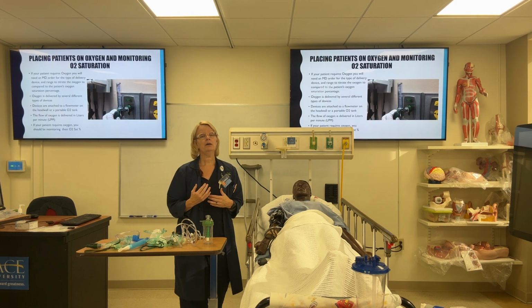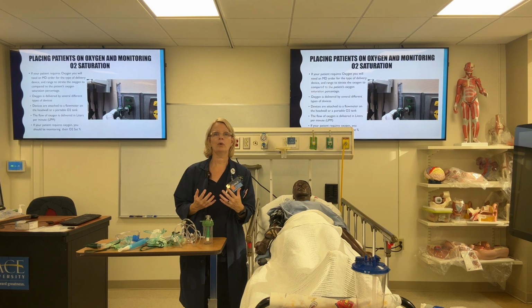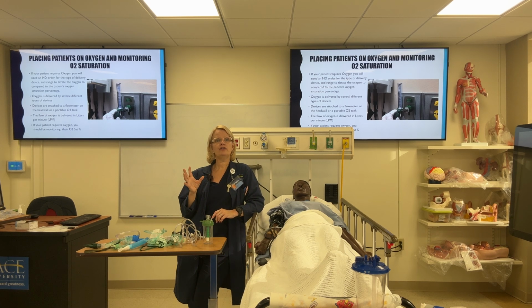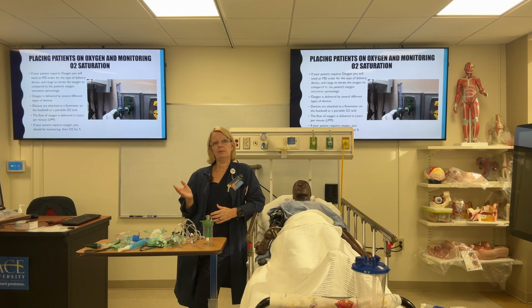When you do finally get the patient on oxygen or get an order for oxygen, you're typically going to see in the order set that the doc will write an order for the patient to be on oxygen, and that you have the ability to titrate the oxygen to maintain an O2 sat of, let's say, anywhere from 92% to 100%. Normal is 100%. We prefer our patients to be over 92%. If they start dipping below 92%, that's troublesome for us, and we want to figure out why.